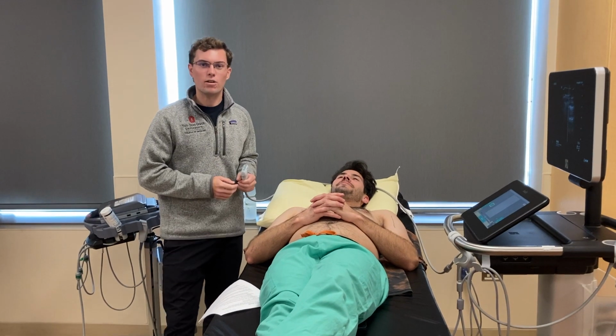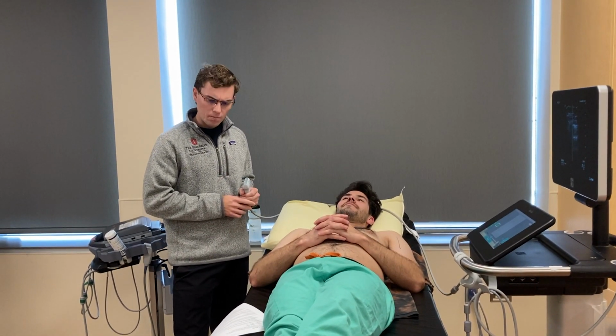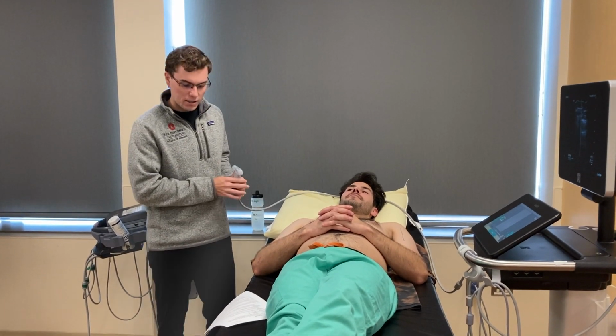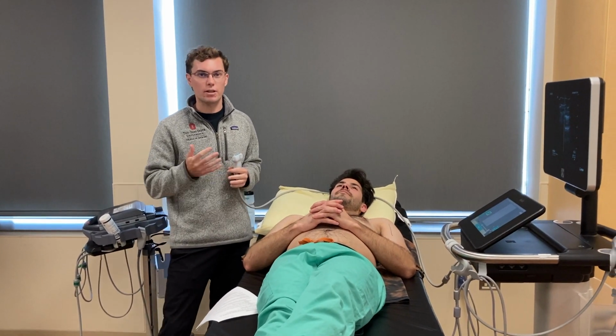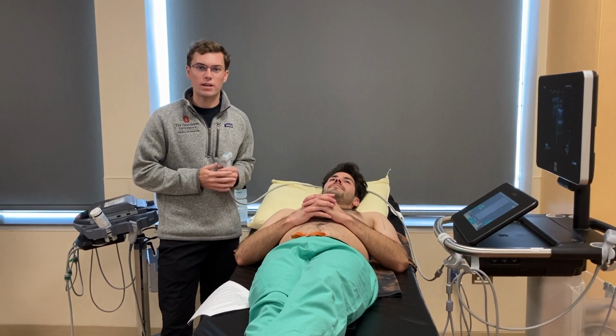For this scan, like all others, the goal is to get the probe in the student's hand as much as possible. And we're going to be looking at the lung ultrasound here. So our indications for this are things like respiratory symptoms, signs of any respiratory pathology like pneumonia, pneumothorax, any uncleared chest X-ray findings that you want to explore more.